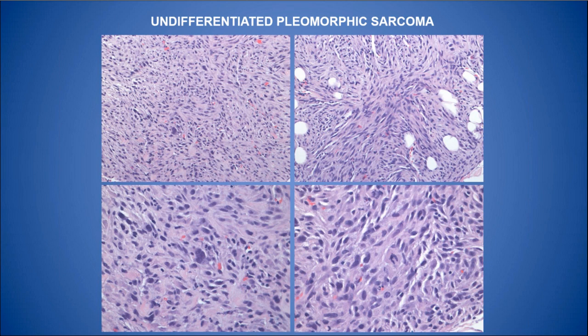The main differential, actually, on undifferentiated pleomorphic sarcoma is a diagnosis of exclusion. So you need to make sure that this tumor shows no line of differentiation. I usually perform a very broad panel of immunohistochemical markers, making sure that this is not a pleomorphic anything, because you may see tumors with similar morphology that may be, I would say, pleomorphic leiomyosarcoma, pleomorphic rhabdomyosarcoma, which are the main ones that we want to distinguish. Pleomorphic liposarcoma would probably be unlikely because usually you do see lipoblasts around it, but sometimes there may be entrapped fat within the lesion that may throw you off.